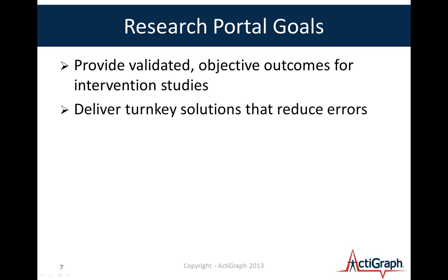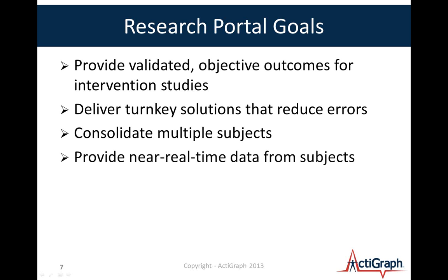We want to deliver a turnkey solution that reduces errors in data collection. So right now our offering is not exactly turnkey, and so we're heading in that direction with the Study Admin Portal. We want to consolidate multiple subjects in a single view, and so you may have a lot of subjects in a particular study or a group of studies, and we want to provide a mechanism for consolidating the information that you gather from those patients.